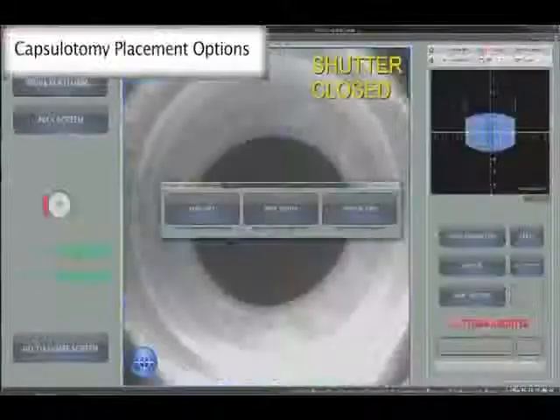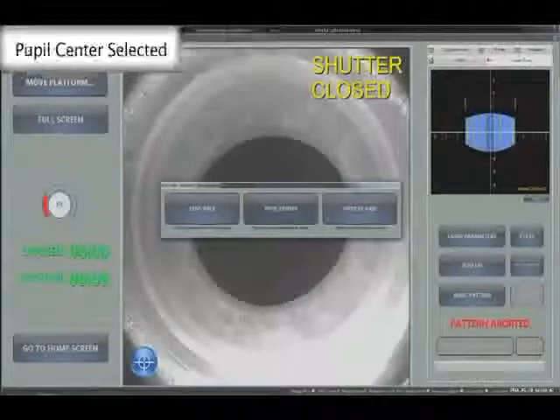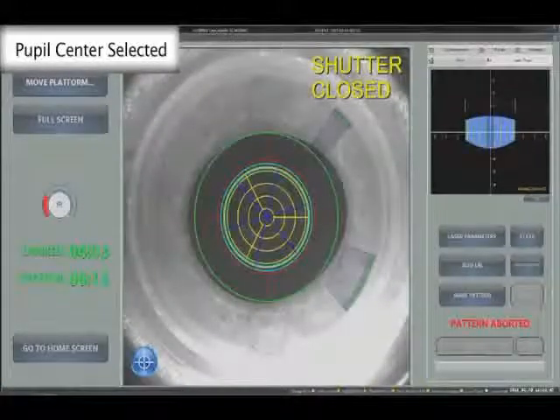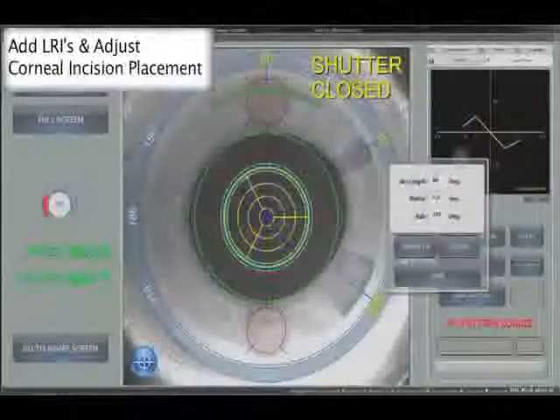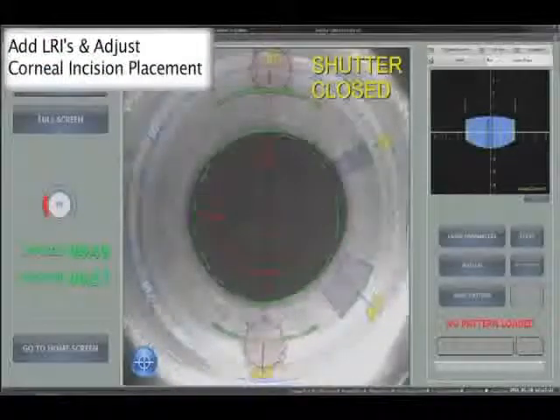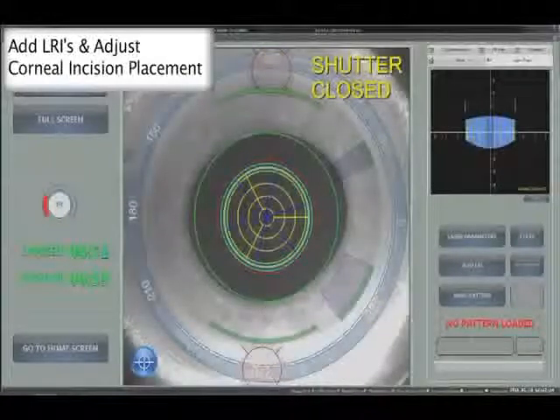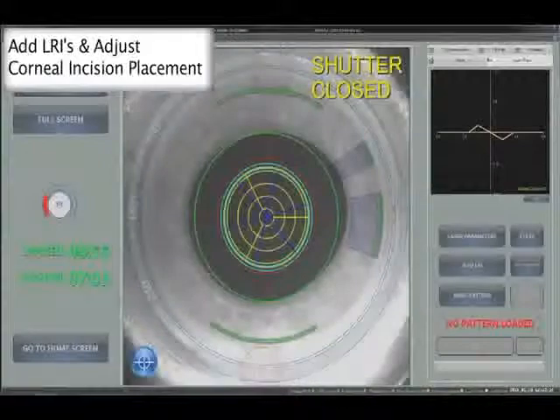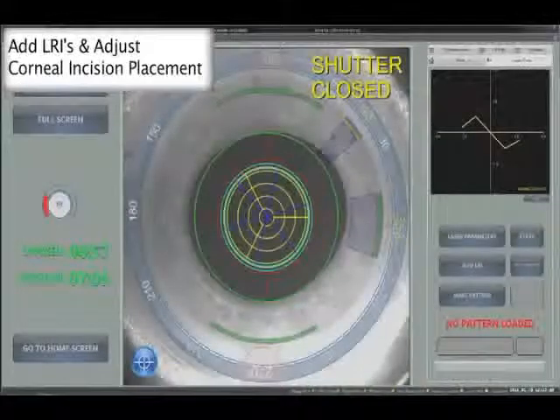Additional information is provided on the degree of lens tilt. The surgical incisions previously programmed for individual surgeons are shown, and any required limbal relaxing incisions can be added as required. The CCI and paracentesis incisions can be moved to different locations and placed at any distance out to the limit of the measured cornea. This can be achieved via the touch screen panels on the system.